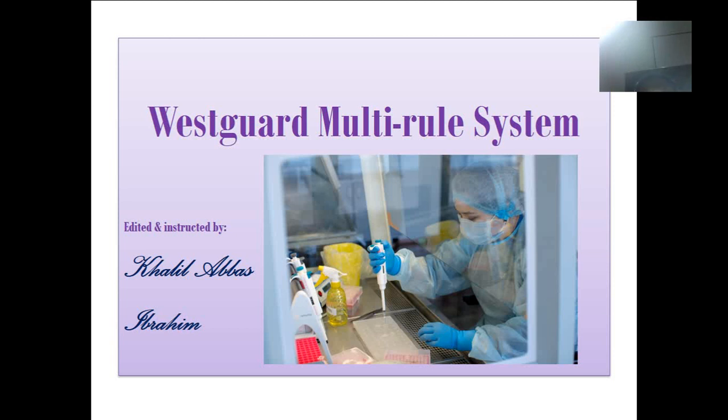The control chart which I have utilized is concerned with the situation when the laboratory is using only one quality control material. And we said that the value obtained by examining that control material, which has been examined together with the patient samples, if that value lies outside plus or minus 2 standard deviation, the measurement is expected to be unacceptable.